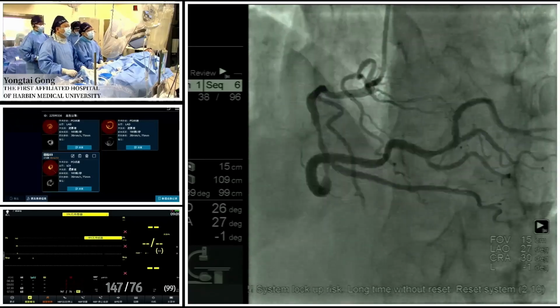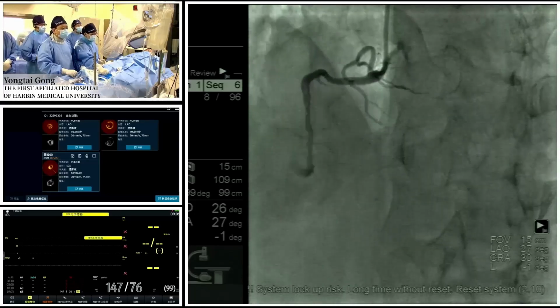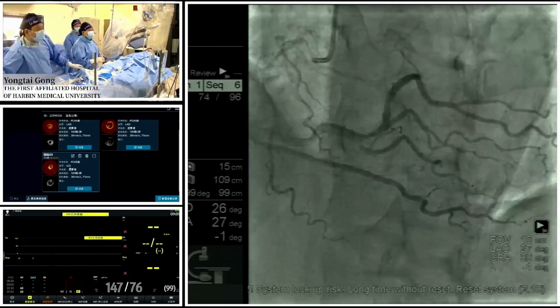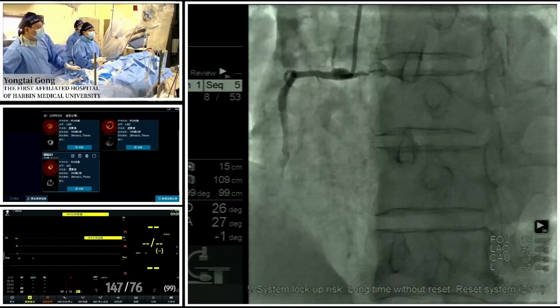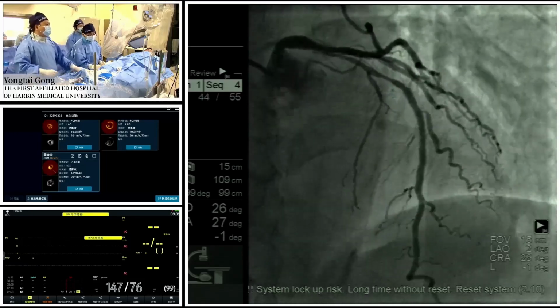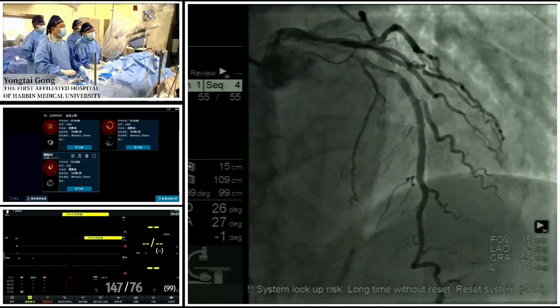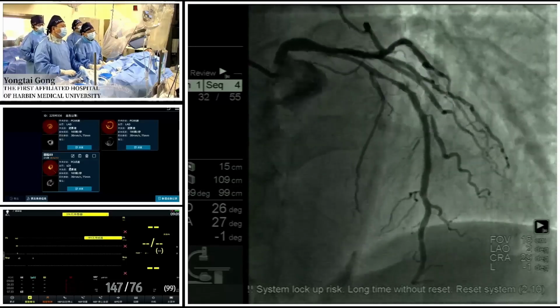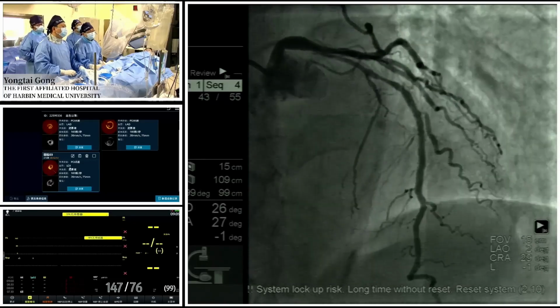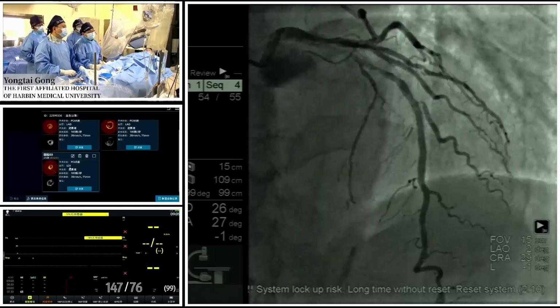All right, thank you so much for the introduction. Dr. Gong, I think we got a very complex case. It's a left main bifurcation lesion with a lot of calcification, and the circumflex looks kind of normal from the angiography. And there's mild to moderate stenosis in RCA, but the functional assessment was negative. But this patient was stented before in the middle of LAD. So right now, based on the patient's information, what's your initial strategy?